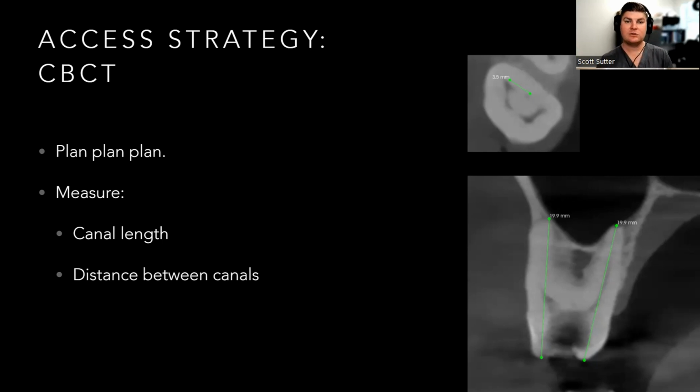Okay, so start doing this, especially with your calcified cases. Measure so you start to get an idea in your head how far it is from one to the other. Okay. Pulpal floor depth is useful on cases not like this one. This was caries, so I'm going to remove the caries and expose it. But on a case that's completely calcified, if you measure to where the pulpal floor is, you can.